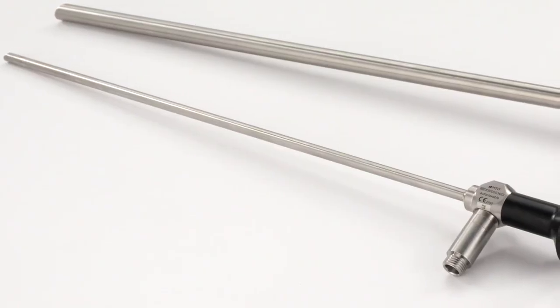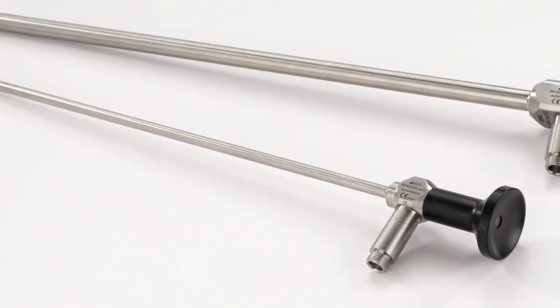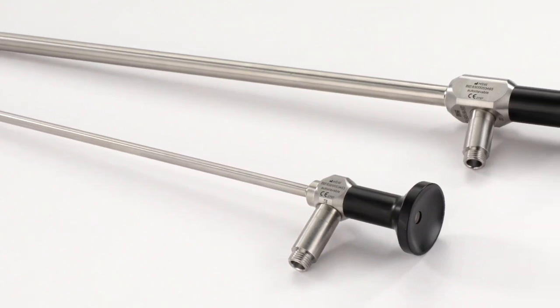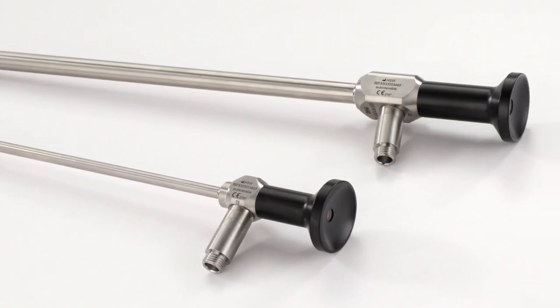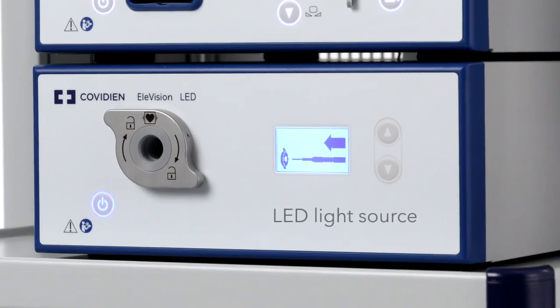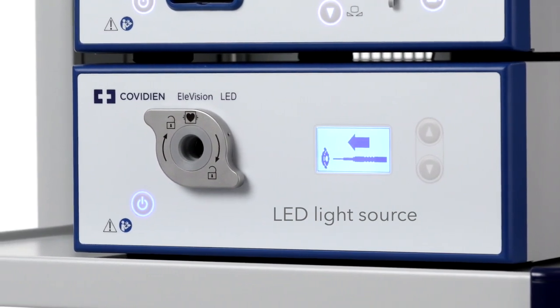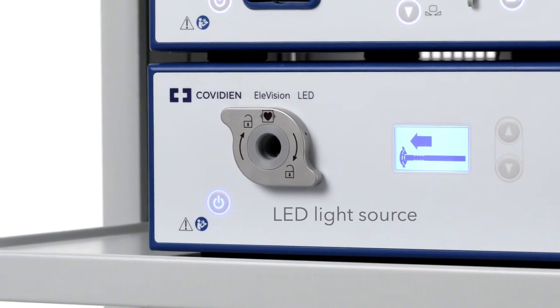The Elevision 4K Plus laparoscopes are specifically designed for 4K visualization and are available in 5 and 10 millimeter diameters and in 0, 30, and 45 degree viewing angles. The Elevision LED light source provides white light with a color rendering index greater than 90 and includes an auto light control function.